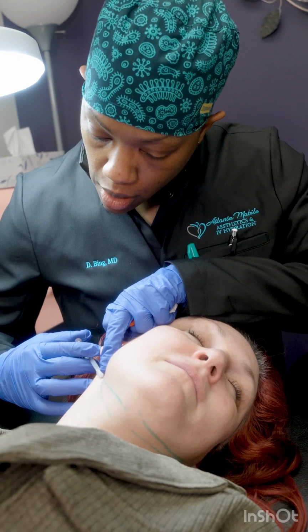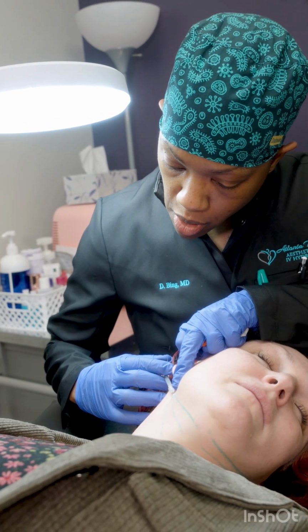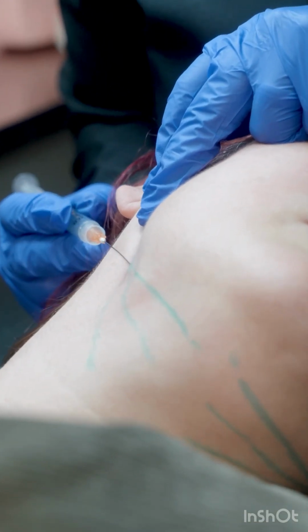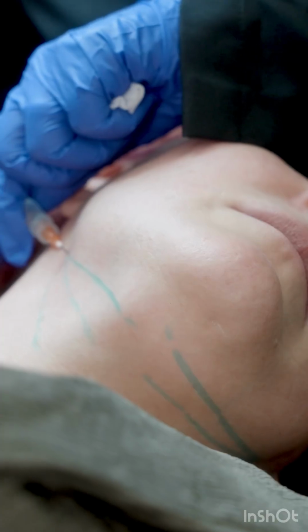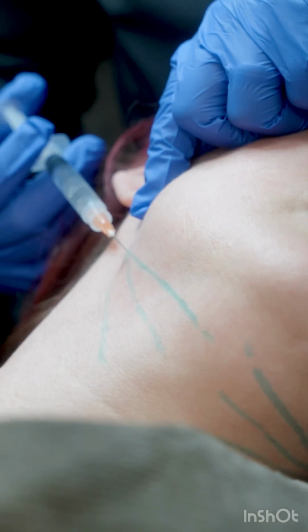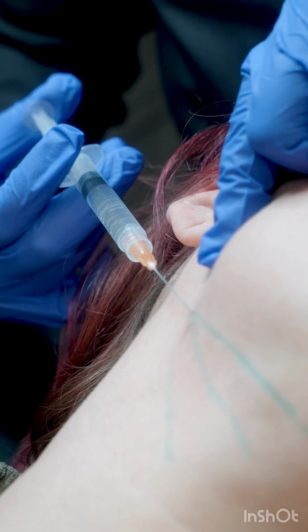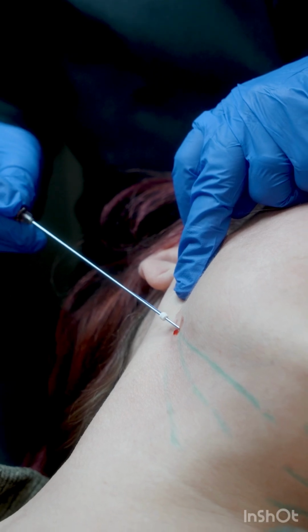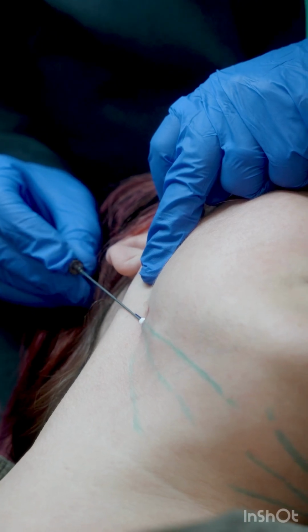I prepare all of the tools to get ready for the procedure, and I start off by applying lidocaine for a local anesthetic effect. Then, one by one, I insert additional lidocaine along the tracks that I've demarcated for additional numbing, which will allow her to undergo the procedure with more comfort. Please take note that not a lot of lidocaine should be inserted in order to decrease the chance that your threads may not adhere to the underlying tissue.